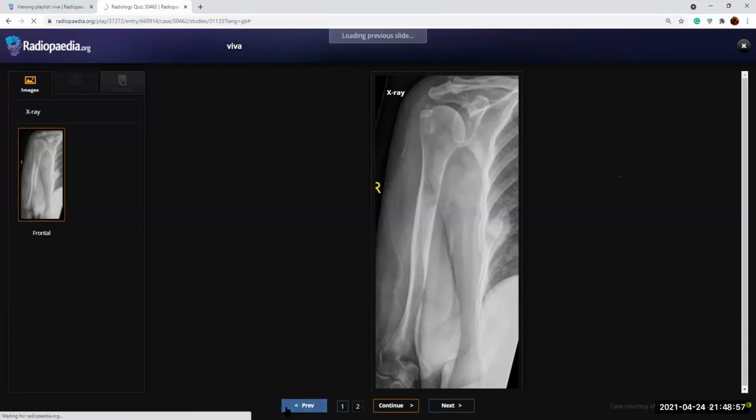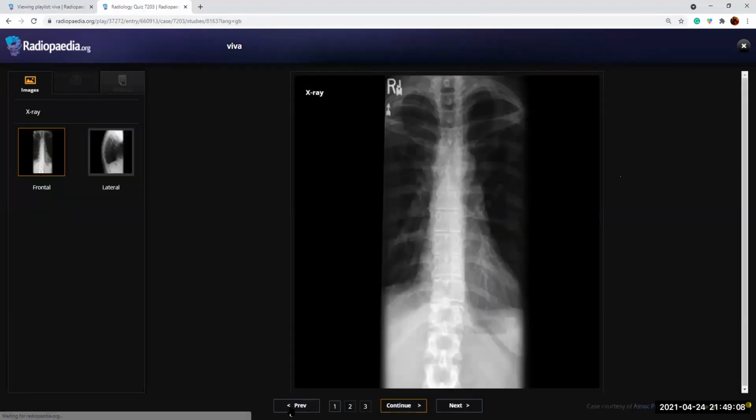Okay. So I think you got everything fine. Just that you took some time picking that CT brain thing. It's pretty subtle. Yes. Right? No, it should have been picked up.